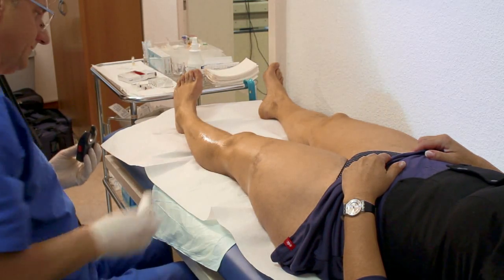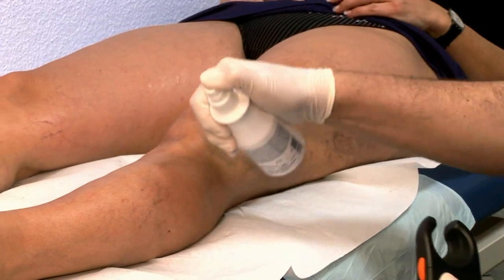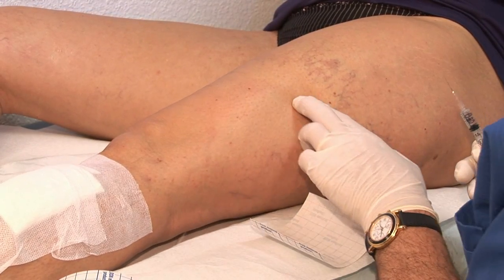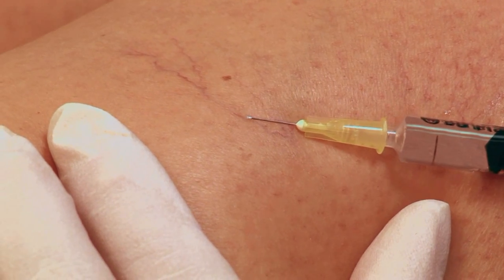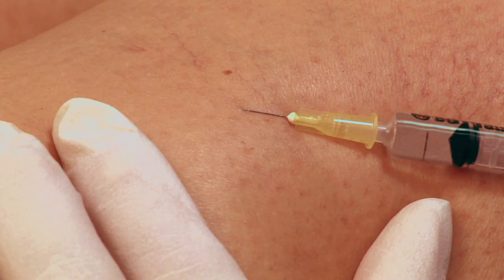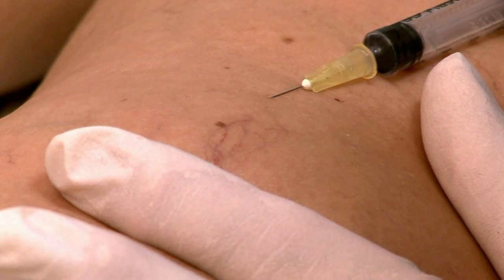The skin area to be treated is disinfected. Most telangiectasias originate in a feeding vein, which forms the telangiectasias in its vicinity. These feeding veins and the confluence points of the telangiectasias should be sclerosed first, so that all the telangiectasias in one area can be treated with one injection.